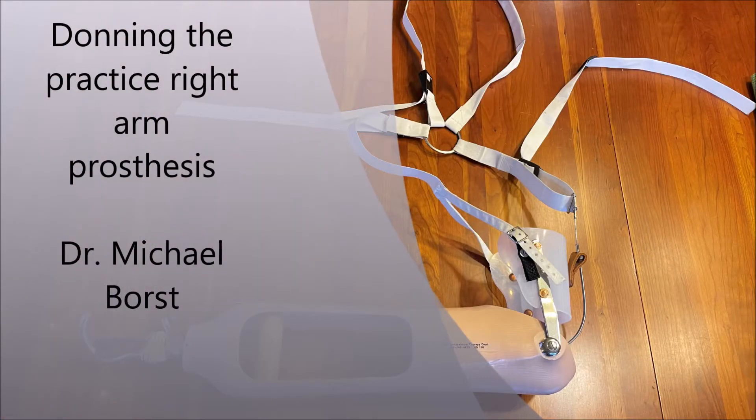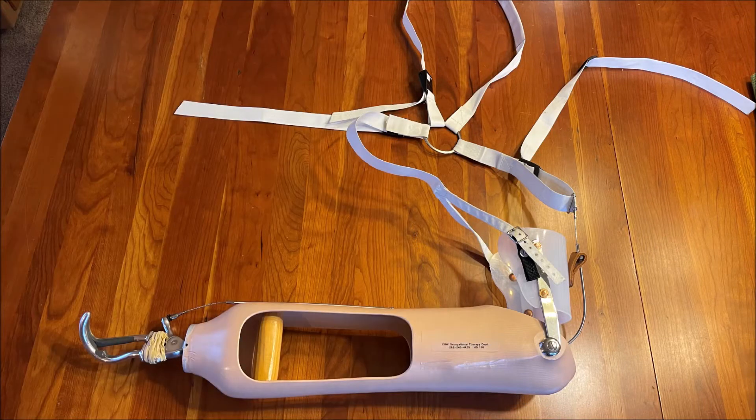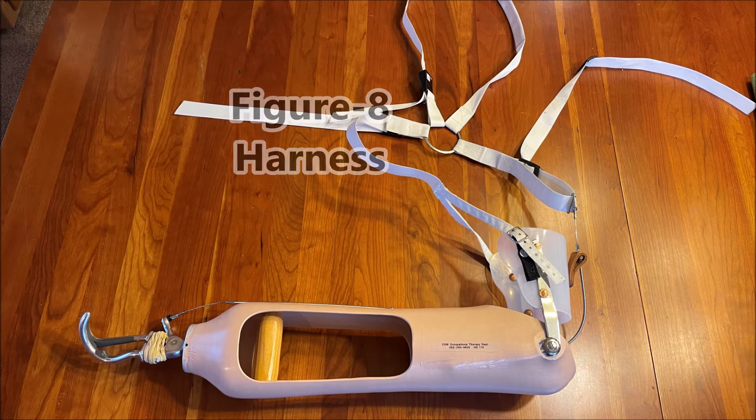In this video, I want to show you how to don the practice right arm prosthesis. It has several parts: the forearm socket, the terminal device, the upper arm cuff, the figure-eight harness, and the axilla loop.